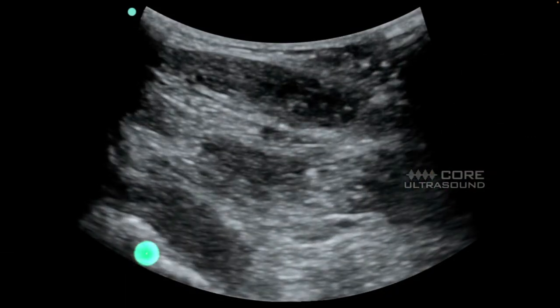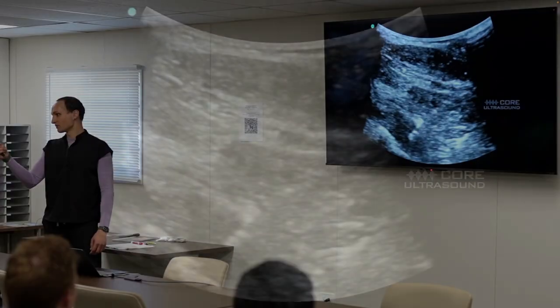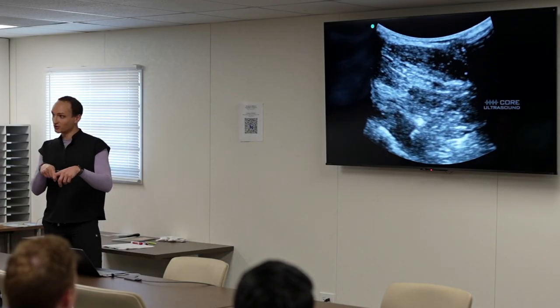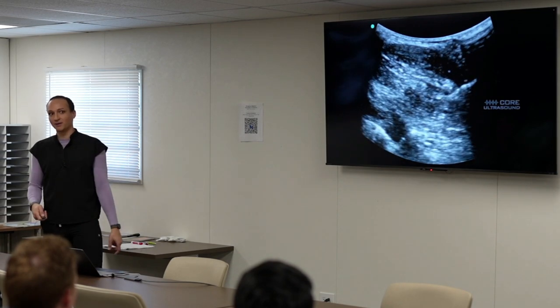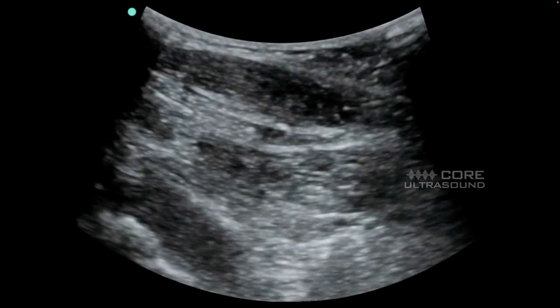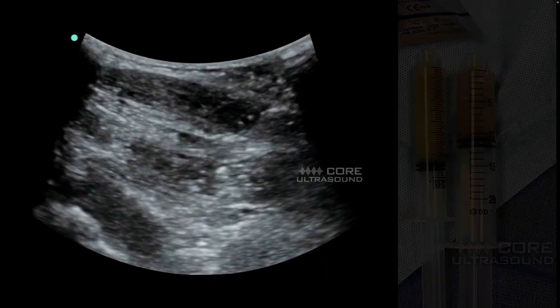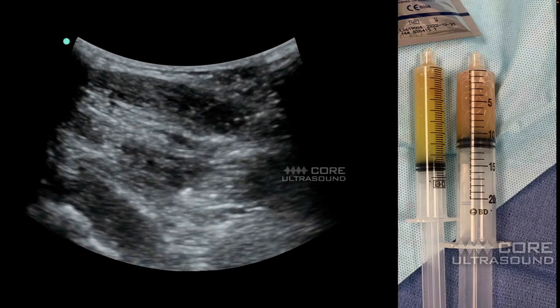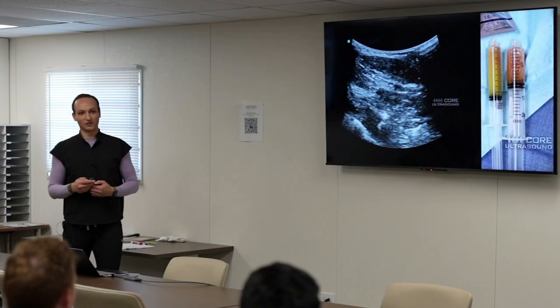Here's an example of a hip arthrocentesis. There's an effusion visible, and the needle is coming in. I don't have perfect needle visualization on this one, but I can see parts of it and I can see the tip is in the right position. Do you want to see what the aspirate looked like? This was an IV drug user — it was gross. They got admitted.